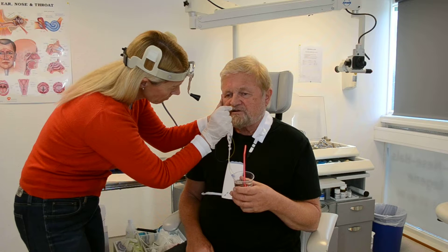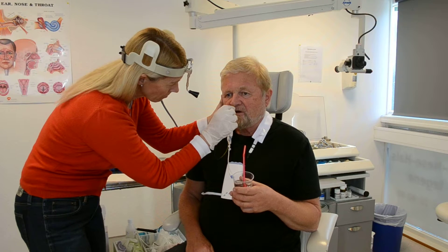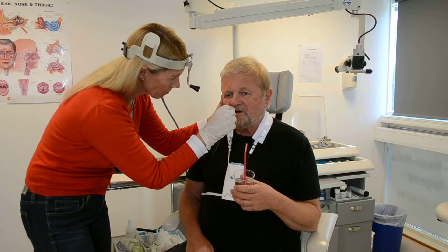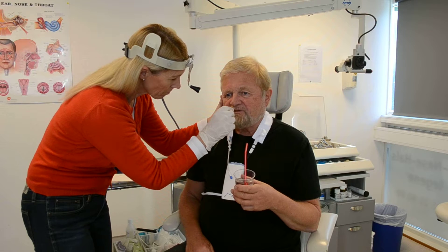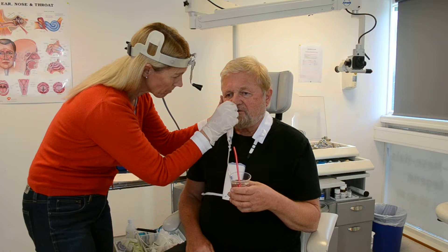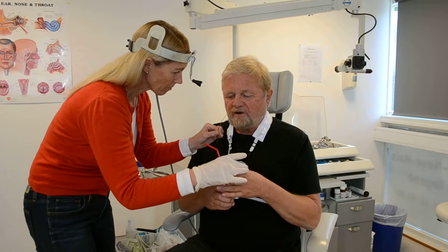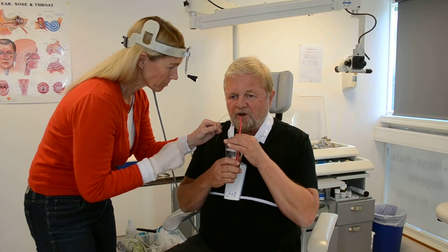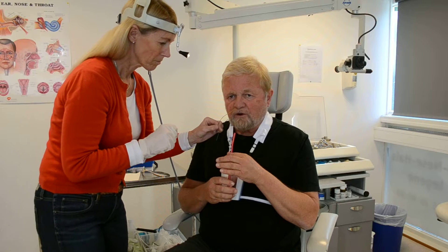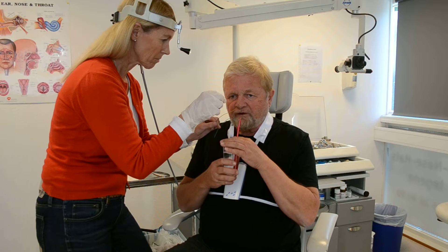Then you very slowly insert it into the nasal cavities, sliding backwardly into the pharynx. When the patient feels it is in the mid-pharyngeal region, you ask them to take a sip — a mouthful of water — and when you say swallow, the patient swallows while you introduce the catheter further down.